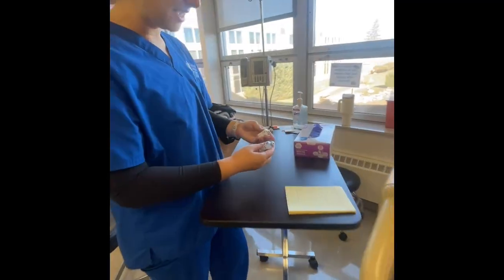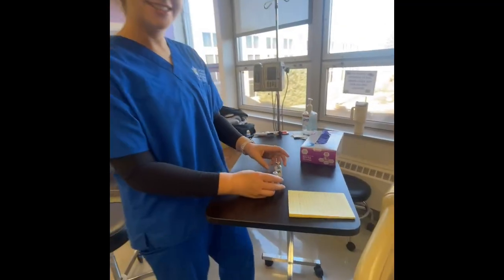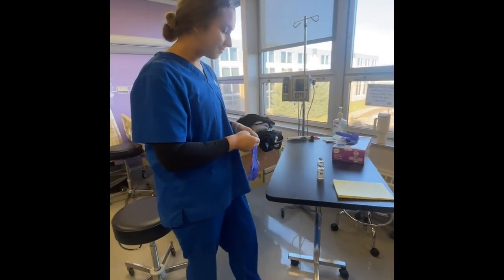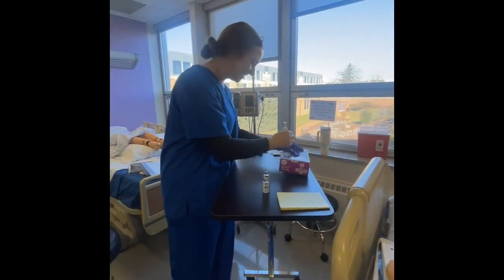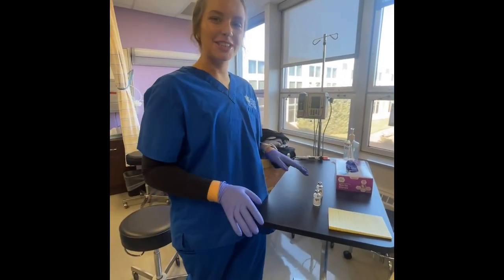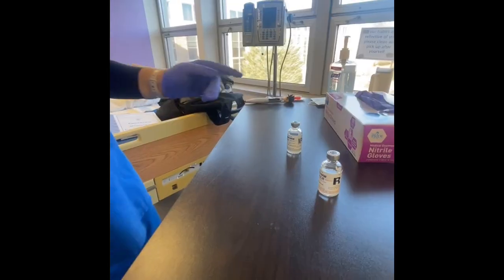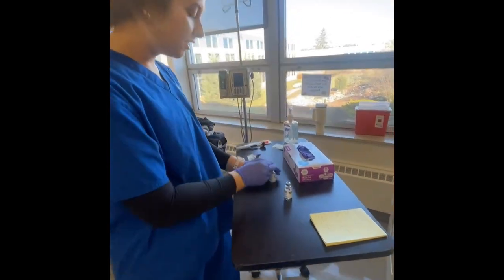First I'm going to examine my bottles, making sure that they look intact, they're not expired, and they look good. Then I'm going to do some hand hygiene and put on some gloves. We want to make sure we're doing this in the correct order, so we're going to inject air into NPH, then regular, and then draw up regular, and then NPH. Now that I have my gloves, I'm going to first clean the vial to prevent any germs.